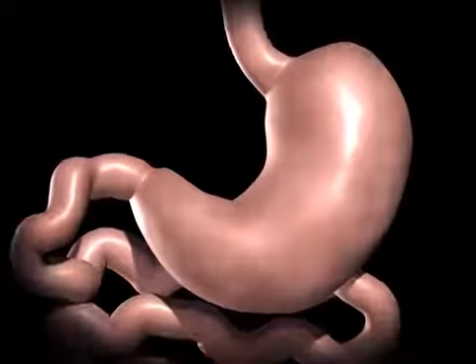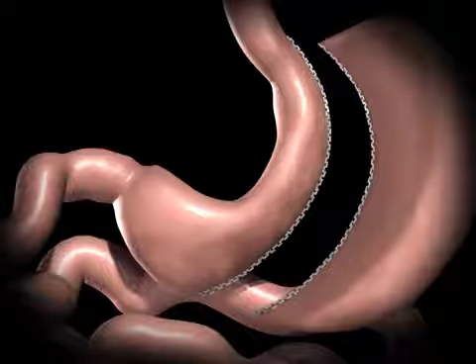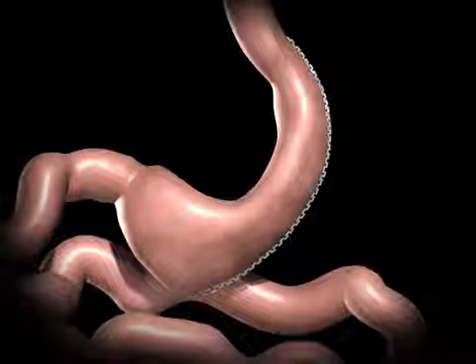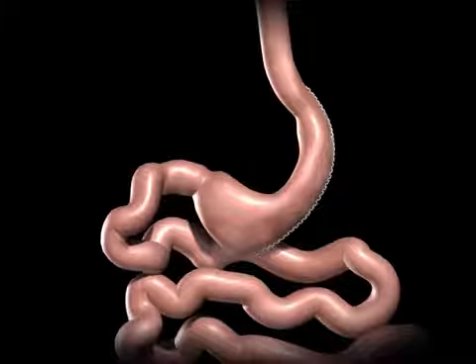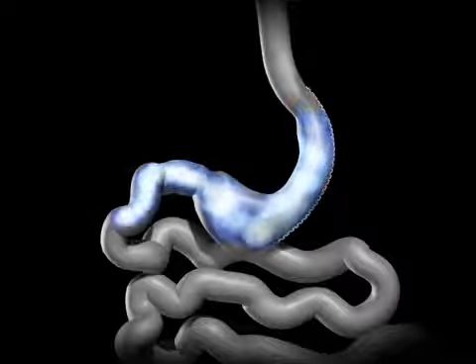During a sleeve gastrectomy, a thin vertical sleeve is created by using a stapling device. This sleeve will typically hold between 50 to 150 milliliters, or is about the size of a banana. The excised portion of the stomach is removed. The newly created gastric sleeve is able to hold approximately one-tenth of what the stomach was able to hold before, restricting the amount of food you can eat before feeling full.